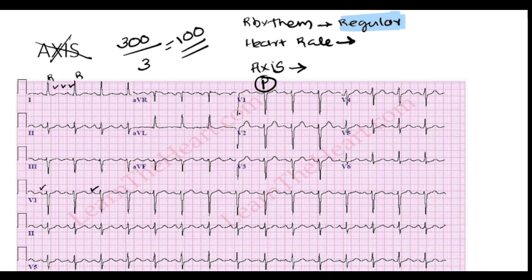So if there is an option in the MCQ, atrial fibrillation, don't in the beginning itself look for P wave. You can get confused in looking for P wave. Some waves, you may think that it is P wave and you may exclude that option, but in fact it may be atrial fibrillation.